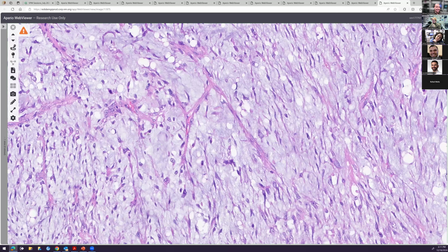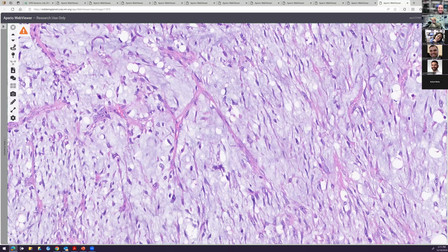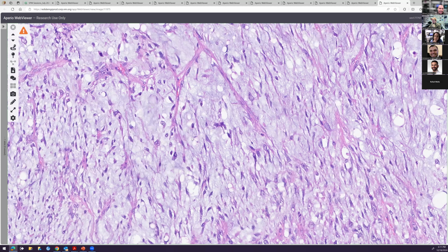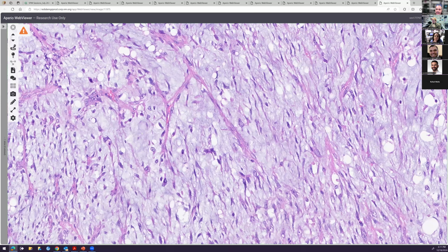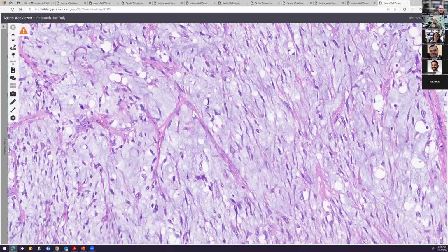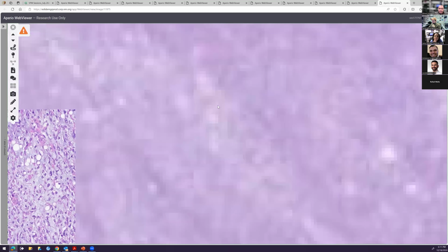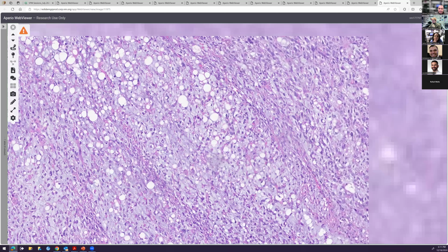I mean, it doesn't look like a myxoid liposarcoma, because something is odd. The vasculature is odd. The vessels are a little odd. That's true. They're a little bit bigger in some areas. But what about these cells? Are these typical of myxoid liposarcoma? No, we don't have these kind of stellate cells. You have some weird pleomorphic cells in here. It's kind of strange. What about as we start to move away from this a little bit?